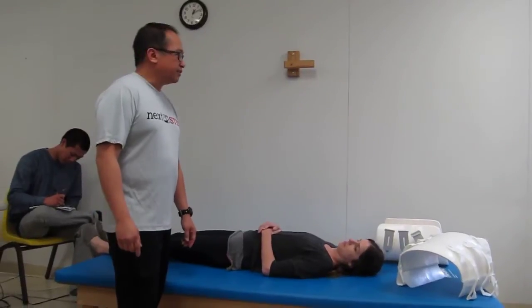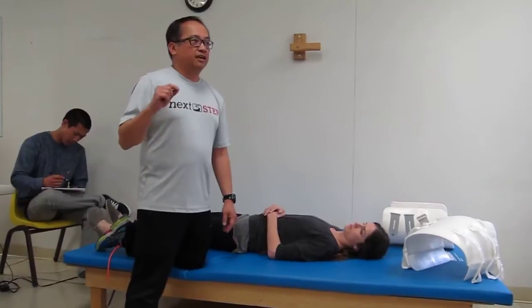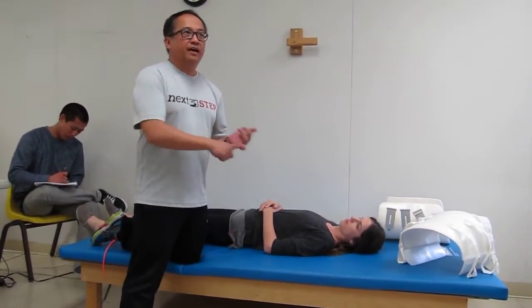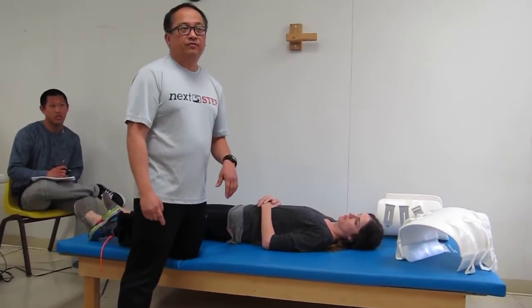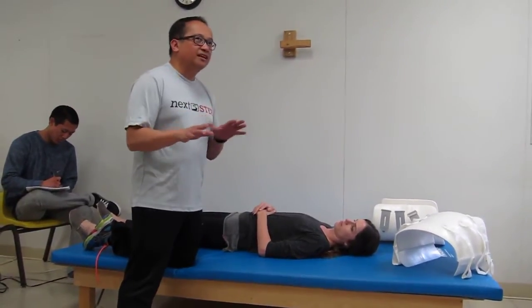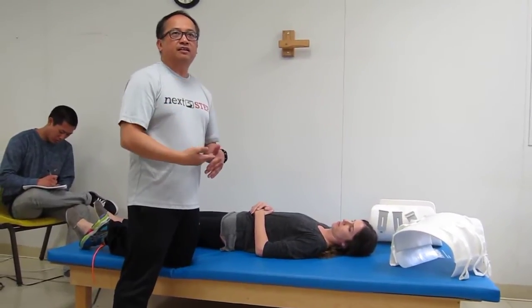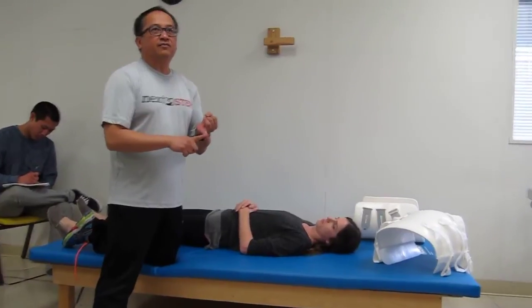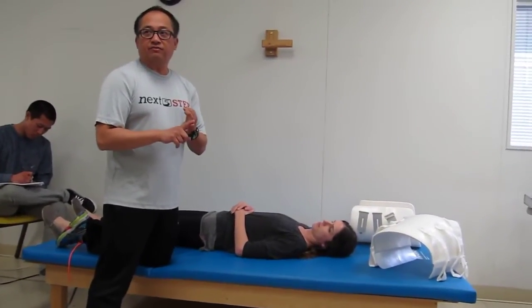The TLSO. Be sure to note in the chart whether the TLSO is supposed to be applied when they're in bed, in supine, or when they're seated up. Very important. Orthopedic surgeons are very quirky in that way, and if it's not clear in the chart, you have to ask the nurse, get her to clarify it, or you have to call the orthopedic surgeon yourself and clarify it.